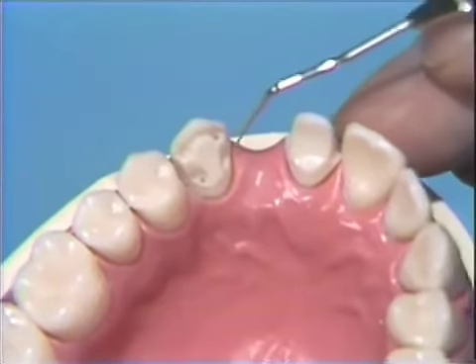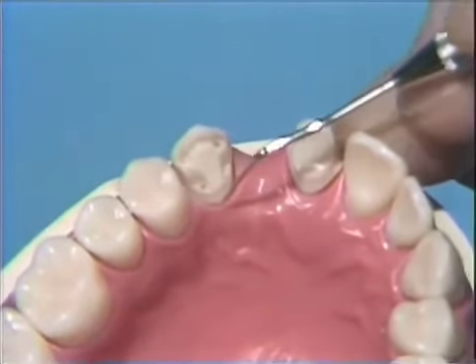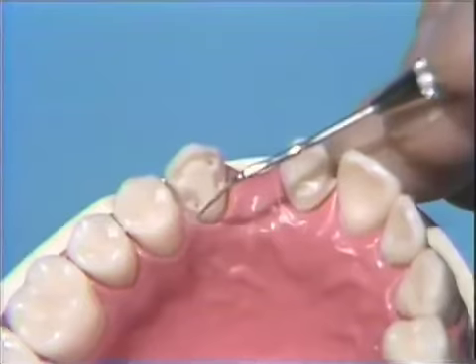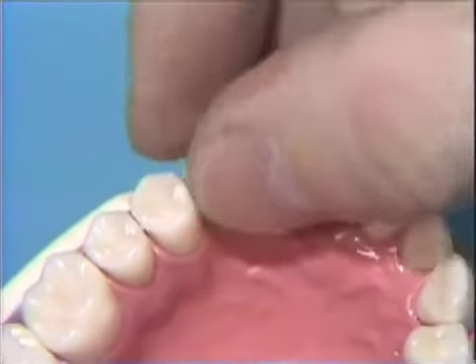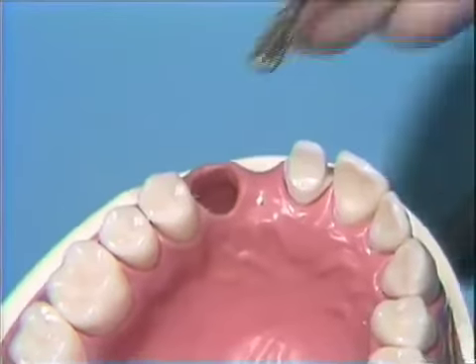When we take the impression of this preparation, we have to make sure that the impression material goes beyond the cervical margin into the sulcus, about a millimeter past the cervical margin. Since the acrylic, or the gingiva, is right up next to the tooth, we're going to have to take this tooth out and relieve the area in the sulcus slightly with an acrylic burr.